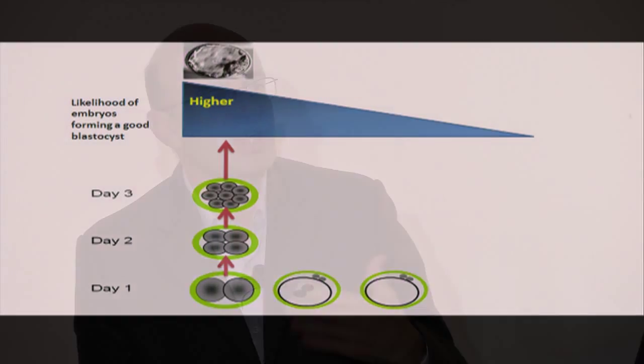But just as when you came in today to New York, I'm sure a lot of you took different roads. I don't think everyone came in the same path. So embryos can get to the blastocyst by various different stages. They can look good one day, they can look poor on another day. So the paths that an embryo can take to get to the blastocyst are really different. But in the end, when they get to a blastocyst or lead to a pregnancy, not all embryos took the same path. So we're unable to get that much information when we're looking at embryos just statically one time a day.